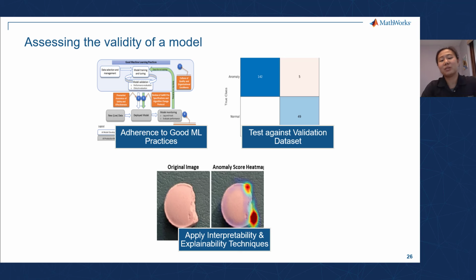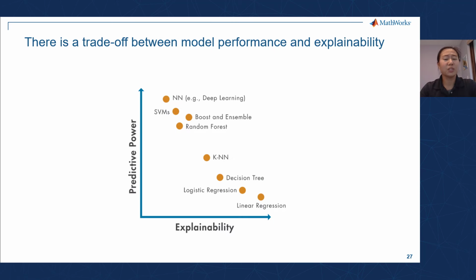But really the important emerging techniques are interpretability and explainability techniques. So to very quickly talk through the ideas here, we're looking at a set of explainability techniques that are really, really difficult to tease out of these models, right?